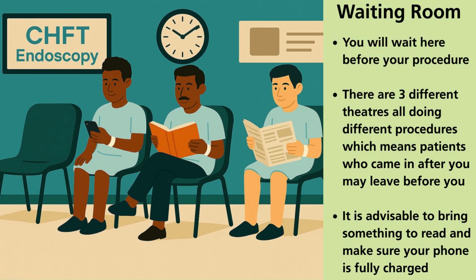After you have discussed the risks and benefits, signed your consent form, and the nurse has completed your admission, you will be taken into a smaller waiting area to wait for your procedure. There are toilet facilities in this area.